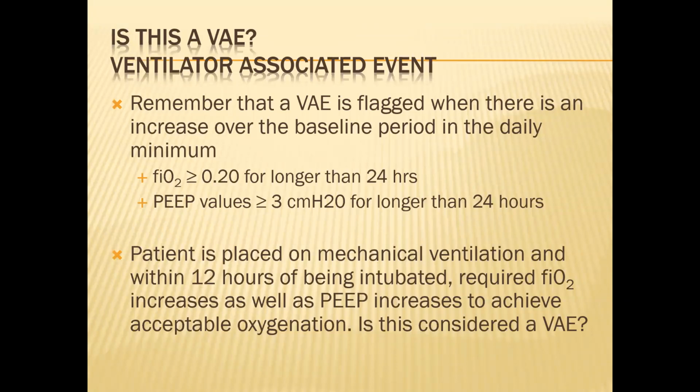So if FiO2 has to be increased more than 20% over 24 hours, that patient gets flagged as having a VAE. Or if PEEP is increased by 3 centimeters of water or more in a 24-hour period of time, that's flagged as a ventilator associated event.